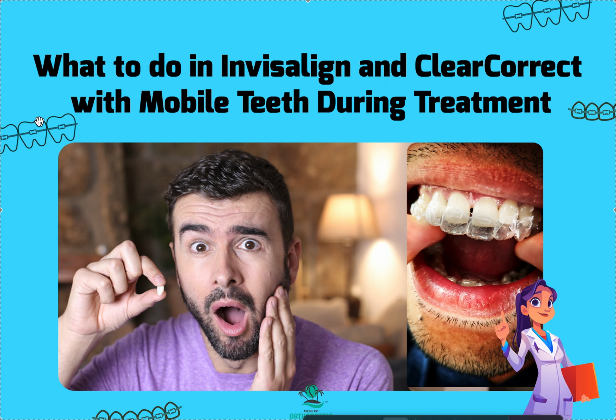And that's a really good quick fix. So I'm taking all these things into account in order to hopefully save my mobile teeth. I'm going to change the treatment plan. I'm going to eliminate proclination, round tripping. I'm going to eliminate premature contacts or any contacts on those teeth. I want to make sure I end the treatment plans with no contacts on those teeth.